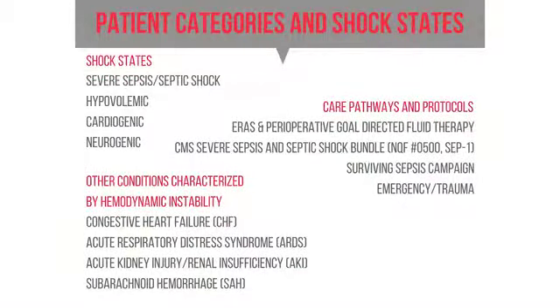Now that we've gone through with you how to do the 2 different types of dynamic assessments, I'm going to talk a little bit about the types of patients that make good Cheetah patients. So let's talk about shock patients, okay? What do we see in all of our shock patients, okay? Hypotension, right? So any type of shock patient, whether it's sepsis or septic shock, hypovolemic shock, cardiogenic shock, neurogenic shock, these are all going to be good Cheetah patients, okay?